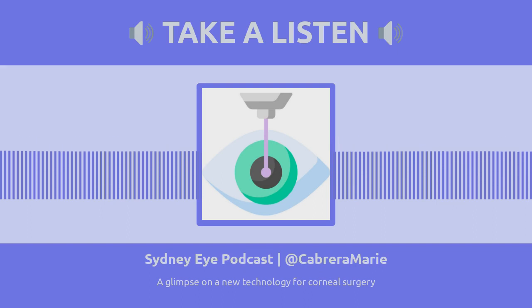So far, their result has been excellent. And then we move on to the cornea. We've done lots of tensile strength testing. This is also not done by myself, but previous researchers. They've done tensile strength testing to see how much strength it takes to split the cornea bits.